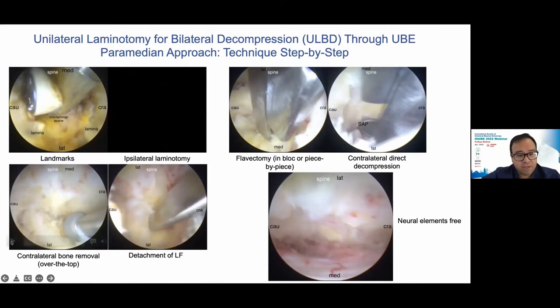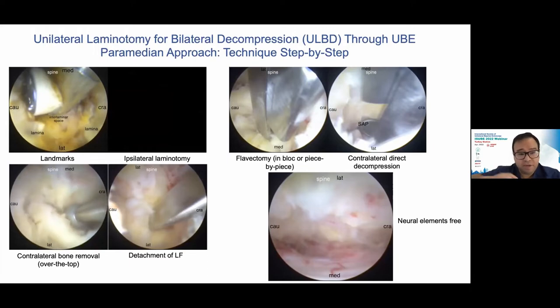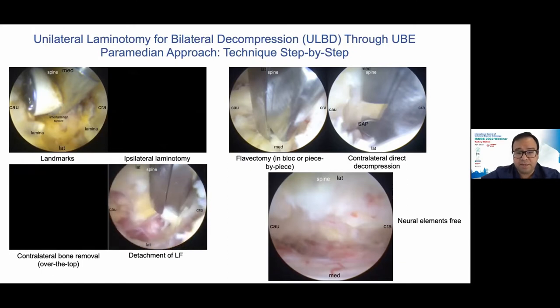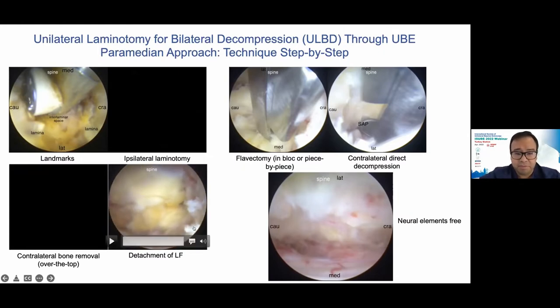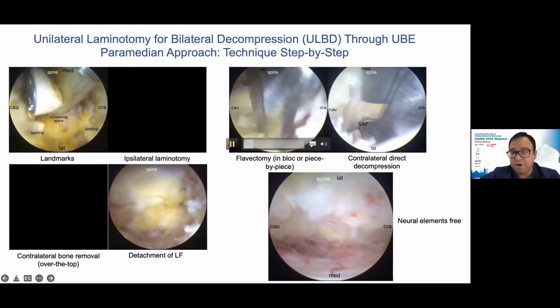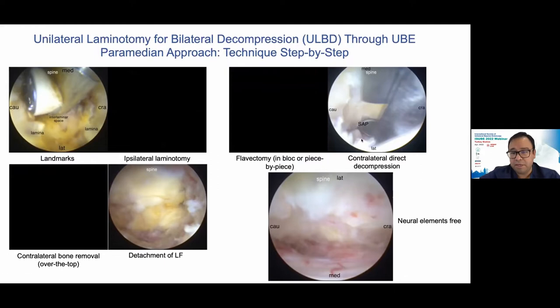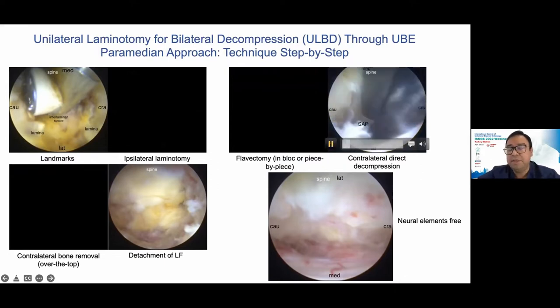After that, you can decompress the contralateral elements, and you can use, as in tubular surgery or open surgery, your ligamentum flavum to protect the neural elements against your instruments, as a protecting barrier for the instruments. Finally, you have to find your attachment of the ligamentum flavum, and you can take it out piece by piece or in block. Sometimes it's very easy to perform the flavectomy in a block way. Sometimes it's easy to remove in pieces. And then you can finally decompress the most lateral part of the subarticular area.